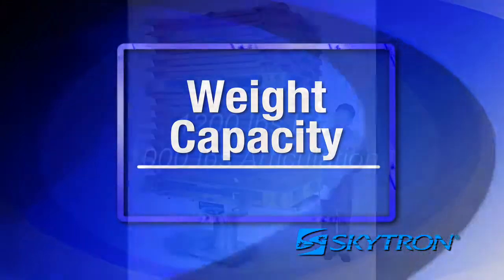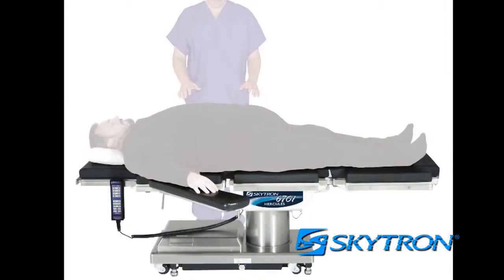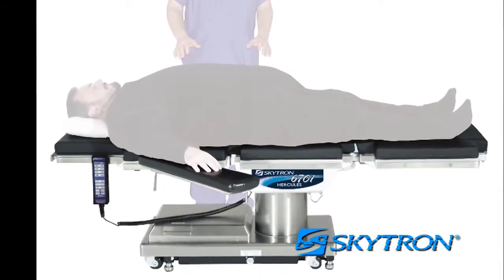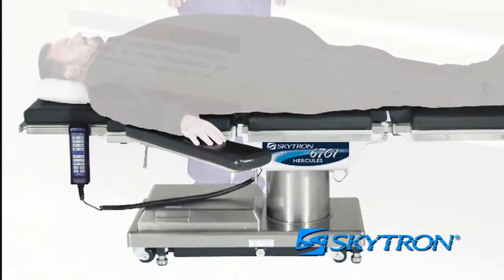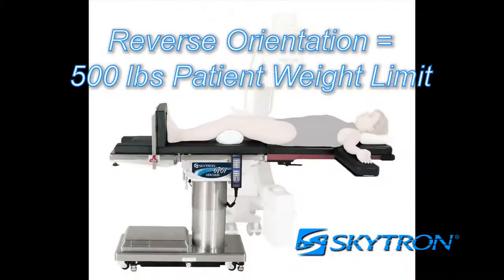The maximum lifting capacity of the 6700 series table is 1200 pounds and the maximum articulation capacity is 1000 pounds. Patient weight capacity assumes the patient is in a supine or prone position with weight evenly distributed across the tabletop and brakes locked at all times. If the patient is set up in reverse orientation — with their head on the leg section and feet on the head section — the table's maximum weight capacity is reduced to 500 pounds.